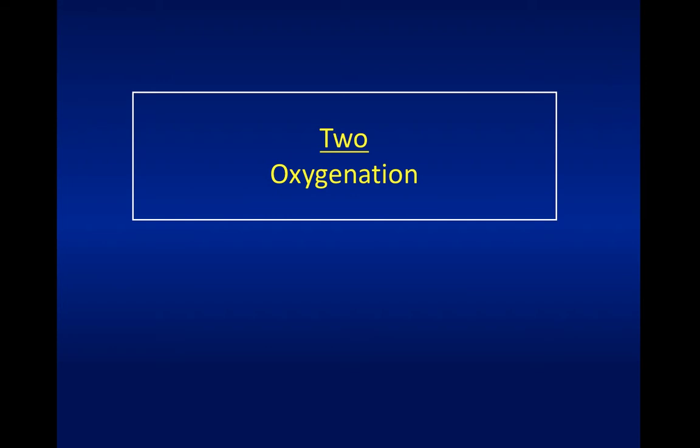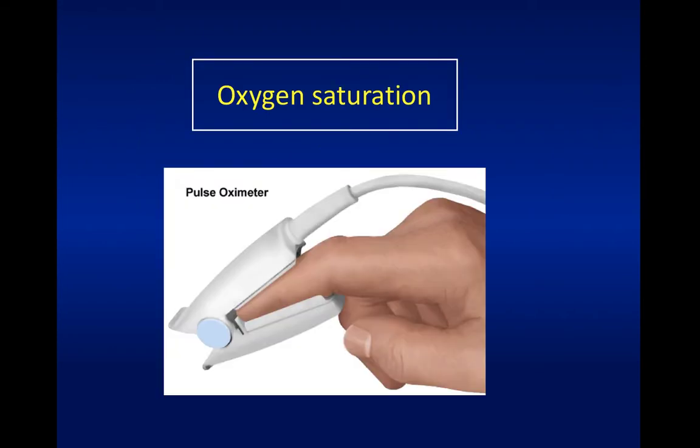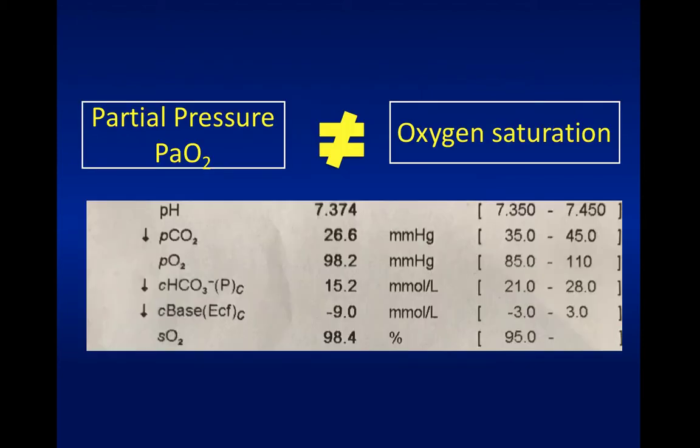All right, oxygenation. So let's have a look at that. First thing to mention: some people will know this is a pretty basic concept, and apologies to people who understand this, but some people will get a bit confused about the difference between oxygen saturation, which you get off a pulse oximeter and also on a blood gas, and the partial pressure of oxygen.